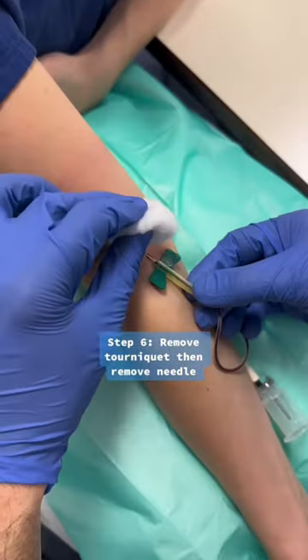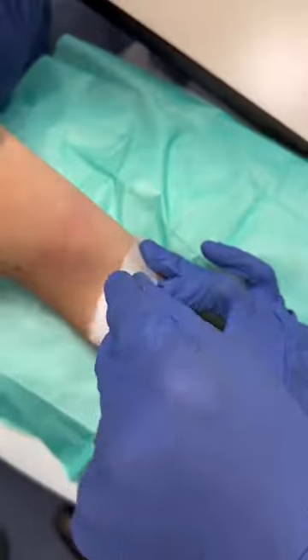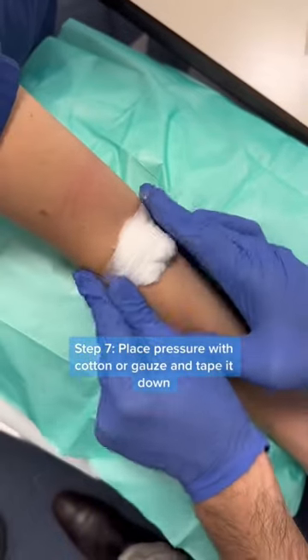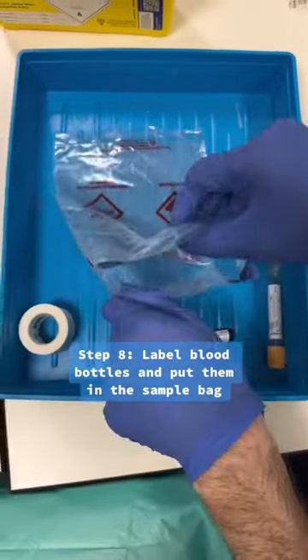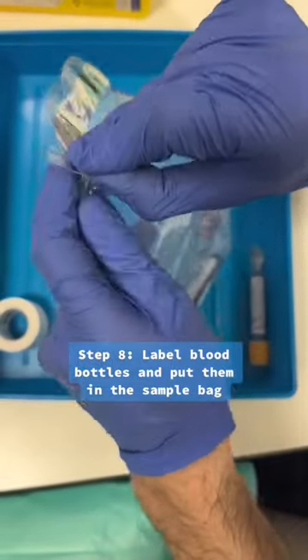Then you want to remove the tourniquet and remove the needle, making sure to put it in the sharp spin and place pressure with a piece of cotton or gauze and tape it down. Then finally, you want to label the blood bottles correctly and put them in a sample bag ready to send off to the laboratory.